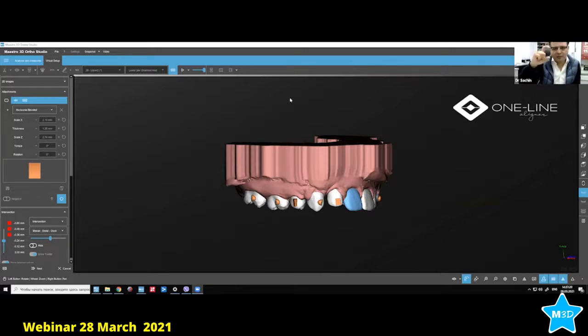If we have 4 square centimeters and it's round, we need one, yes. So we can actually get to a point. So it's going to be at least maybe 50 or 60 combinations for every single tooth. What kind of attachment, which place, and then if Andrea can incorporate all those in the software, maybe yes. We need more AI.